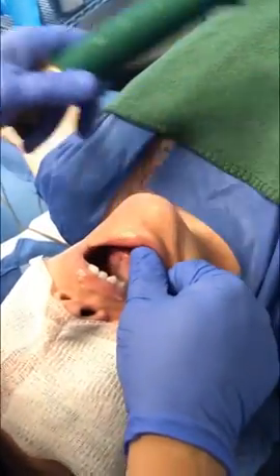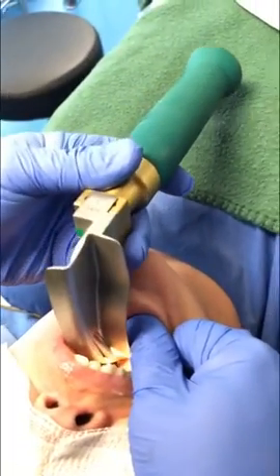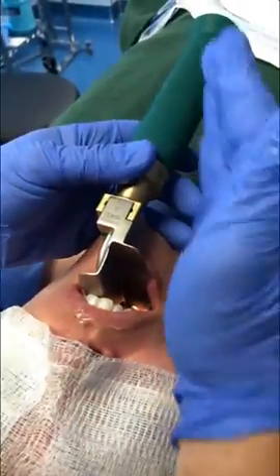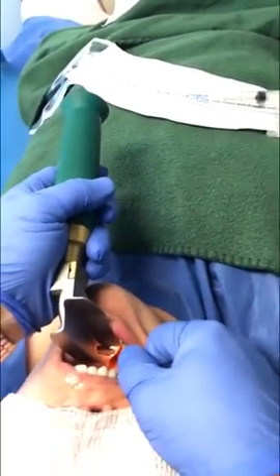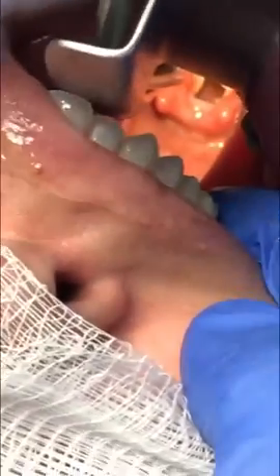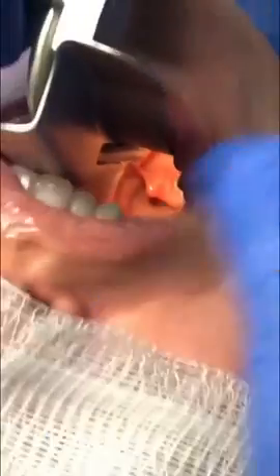Let's do that now. Guys, scissoring motion in the corner of the jaw here, subluxing the TMJ, and then let the blade slide right down the right gutter. And then I'm going to pull in this direction towards the left foot. You see the epiglottis right there? There's the epiglottis, and I can rotate it up to let you guys see the airway. And you can see the tube just going in laterally through the cords, and she's home.